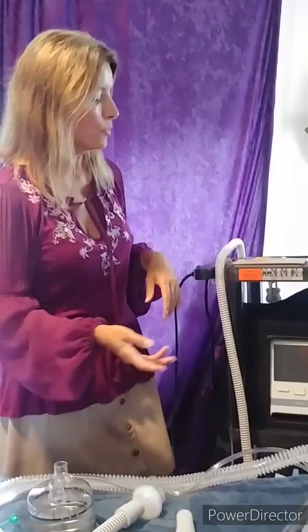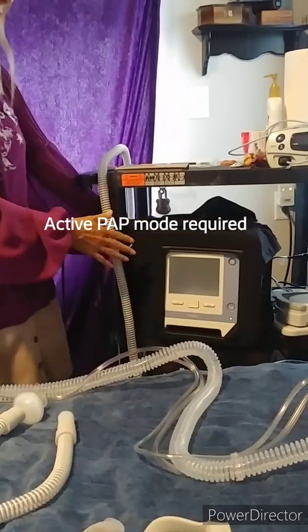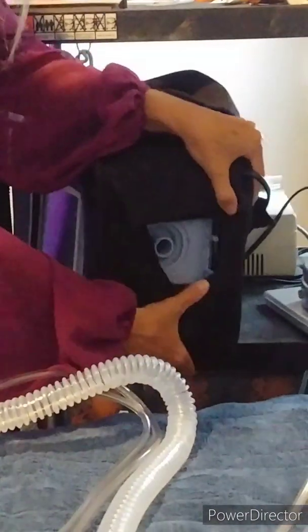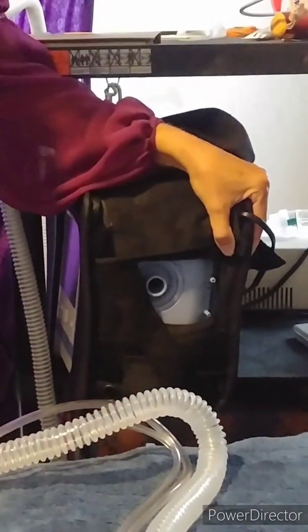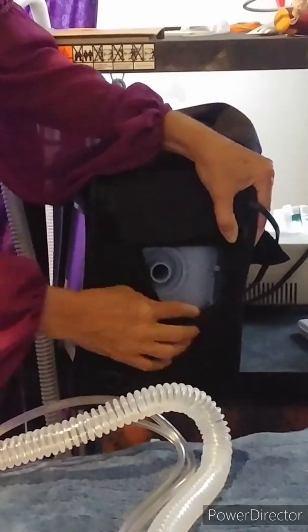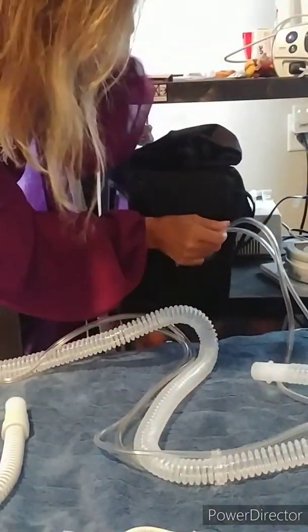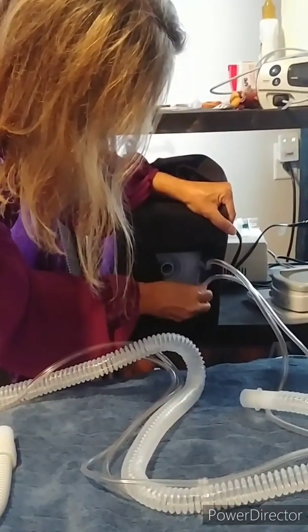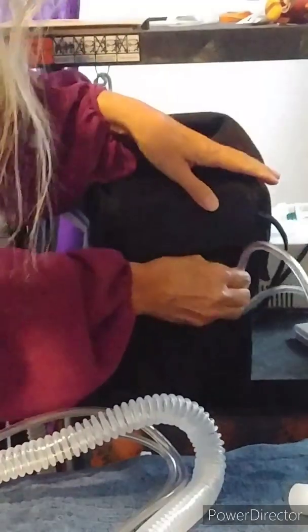Once you get to that point, a couple of things would have to change. This is the Trilogy 100, and one thing that would have to change is the panel would have to be switched out to the active panel. You can see that this panel has two ports on here, which is different from how yours would look if you were using the passive circuit. Those are where these two tubes connect — one is slightly wider than the other.